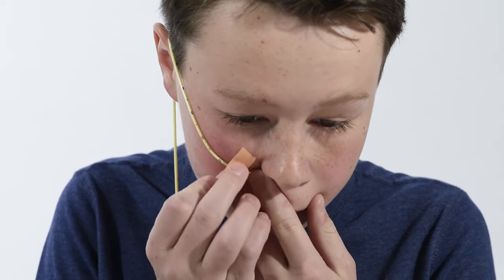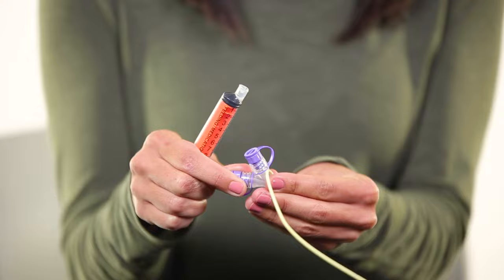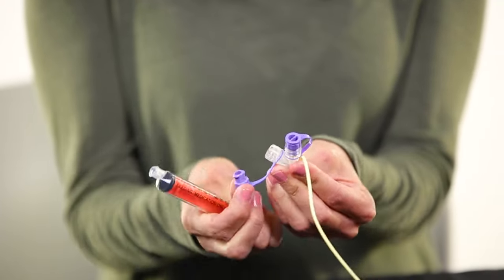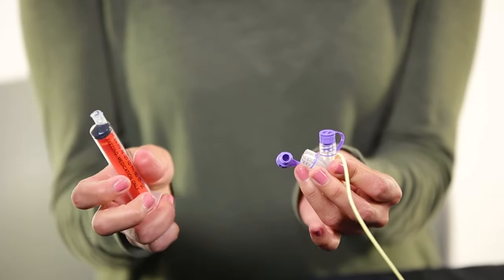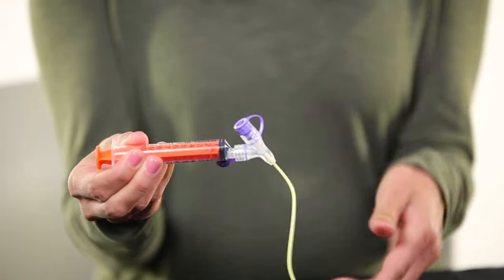First secure the tube by putting on a dressing or tape or by holding the tube in place. Grab the large syringe, clamp the NG tube, and remove the cap from the tube. Attach the syringe to the end of the tube.